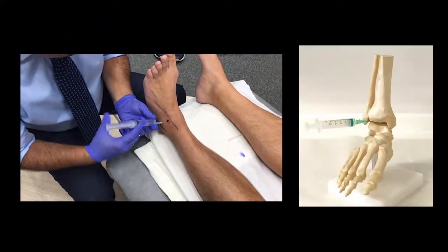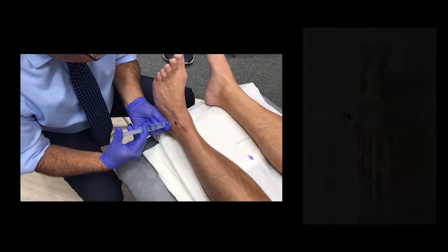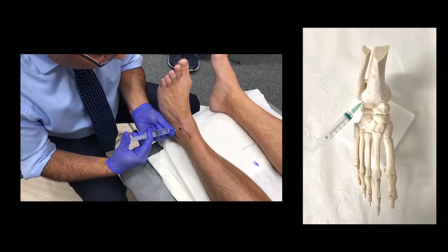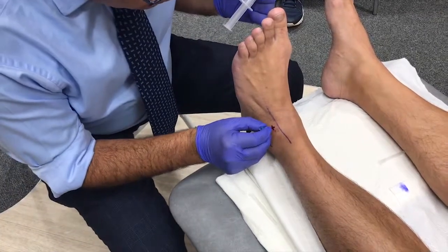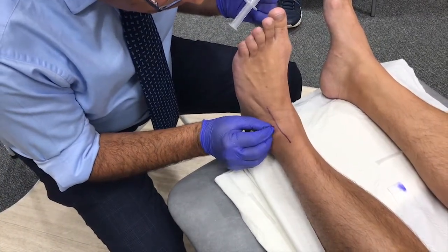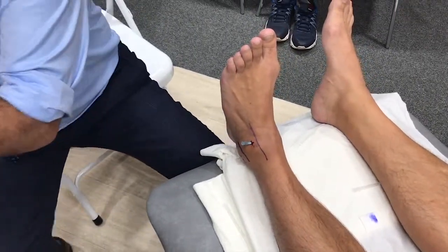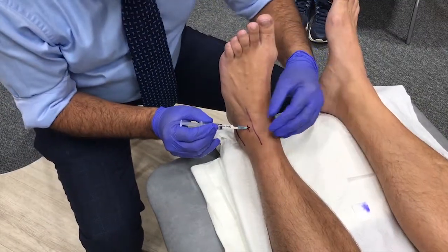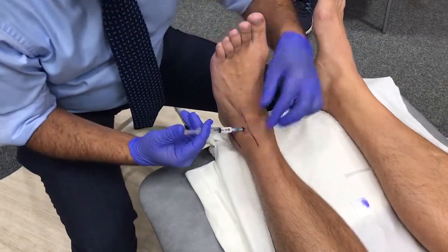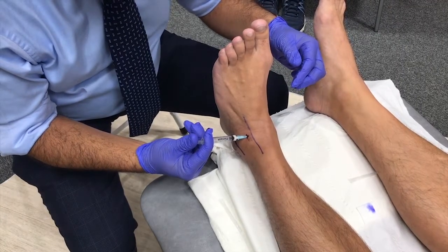Using the 10 cc syringe with a blue needle, 1 ml of lignocaine is injected first superficially and then deeper. The needle is used to find the ankle joint, and it goes in relatively smoothly. Once in the joint, inject 1 ml of kenalog, which should also go in smoothly without resistance.